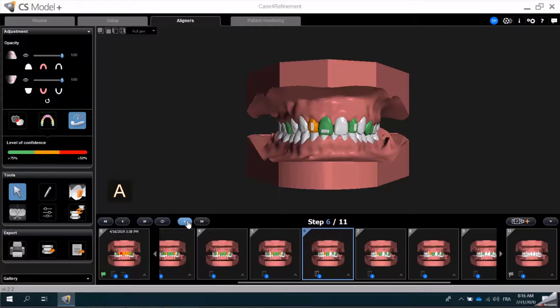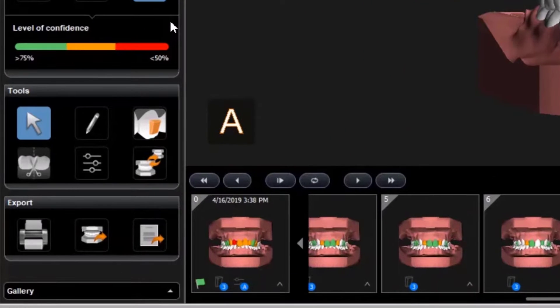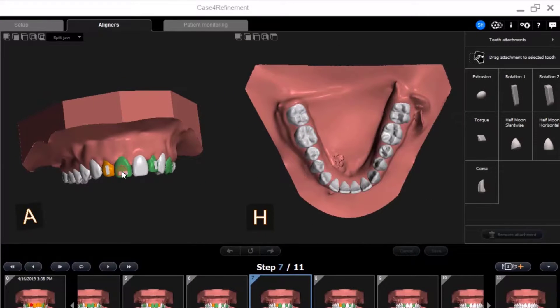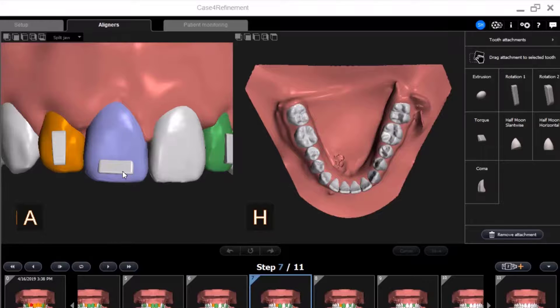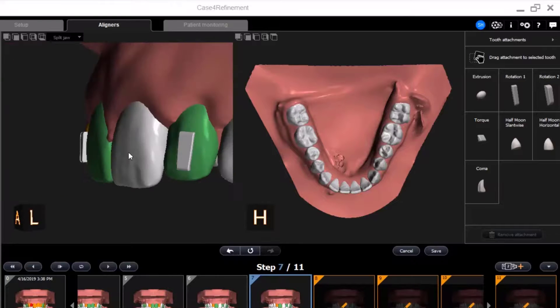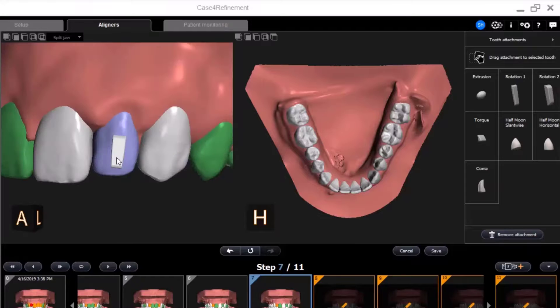When I get to Step 7, I'm going to remove the attachments on the teeth that now appear in green because only minimal movement remains in the treatment plan. I'll begin by selecting Edit Tooth Attachment. Next, I'll click on the attachment I would like to remove. The tooth color is then highlighted in blue, and I can select Remove Attachment. I can remove as many attachments as needed. Once I have removed all of the attachments, I'll click Save.